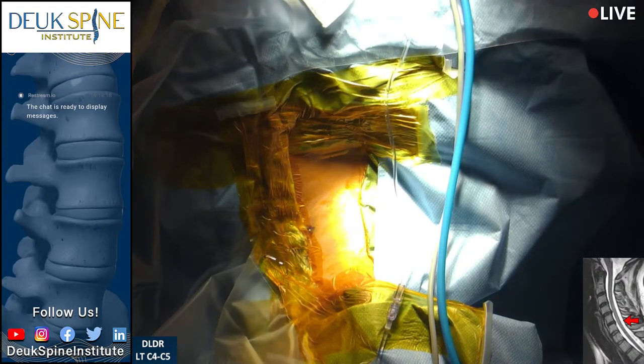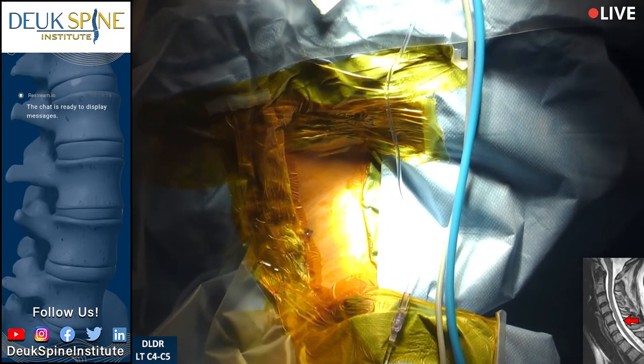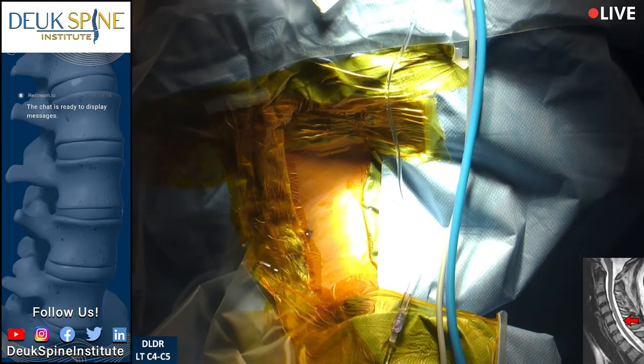Deuk Laser Disc Repair. This is anterior cervical endoscopic spine surgery used in the treatment of a herniated or bulging disc. You can see from the MRI image on the bottom corner of your screen that this patient has a disc herniation — a small disc herniation. All of the disc herniations have an annular tear in the back of the disc, and hers is at C4-5.